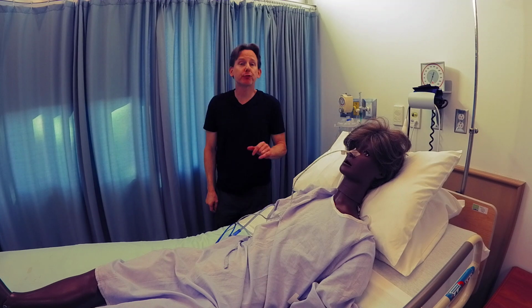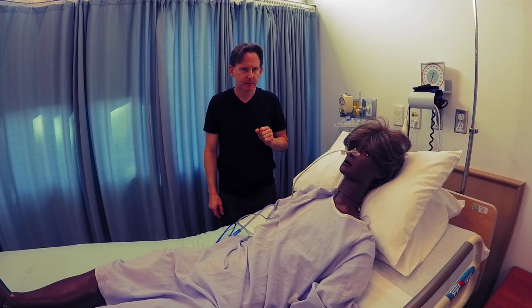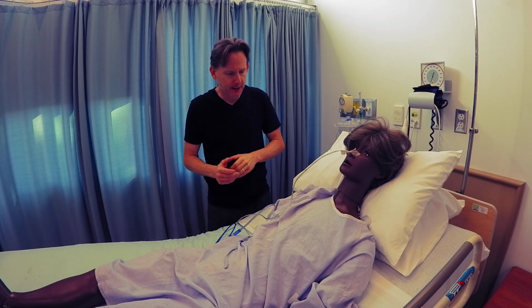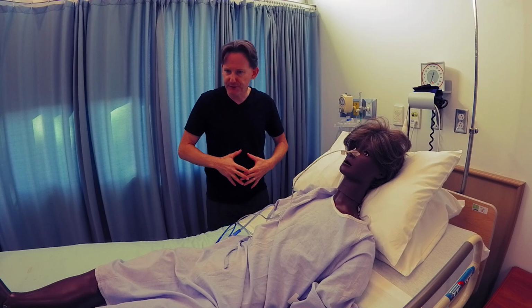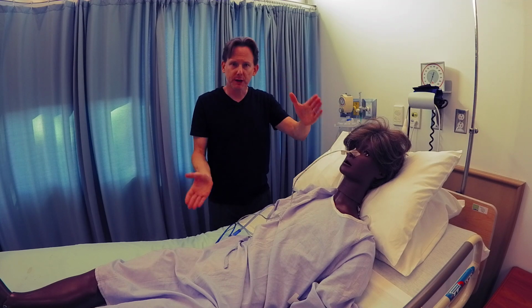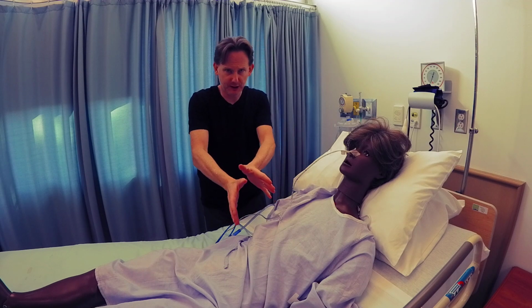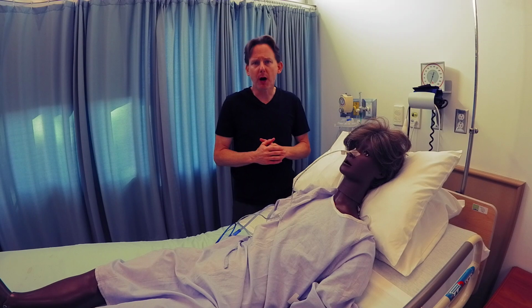In this video, I'm going to briefly discuss some troubleshooting around nasogastric tubes. So let's say you come to assess your patient and they say, I have nausea, and they feel bloated and distended. That would be odd if the NG tube was working perfectly well. After having done an abdominal assessment and talking with the patient, we need to re-examine what could be going wrong with this NG tube.